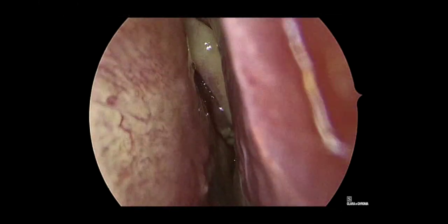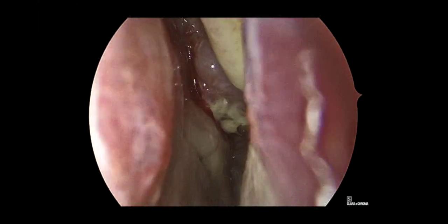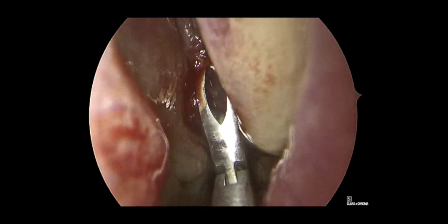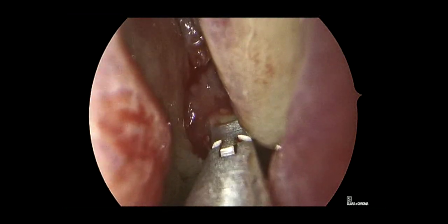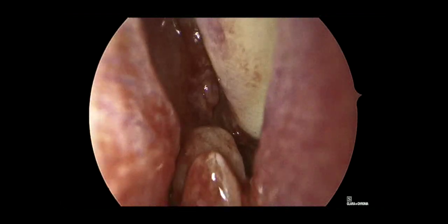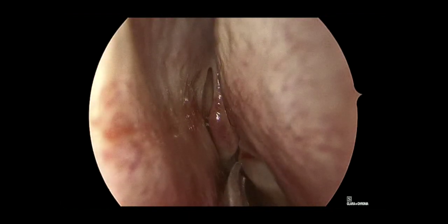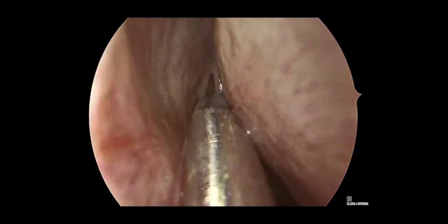Here we are examining the patient's nasal cavity, taking a few frozen section biopsies at the beginning of the case. Although we had a diagnosis ahead of time, I always like to get a frozen at the beginning just to confirm diagnosis and preclude any surprises later on.